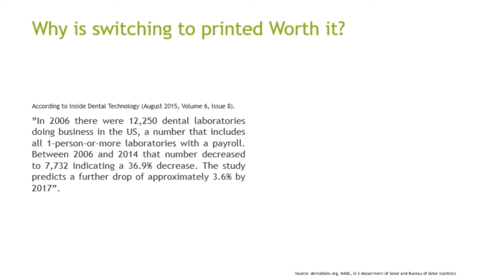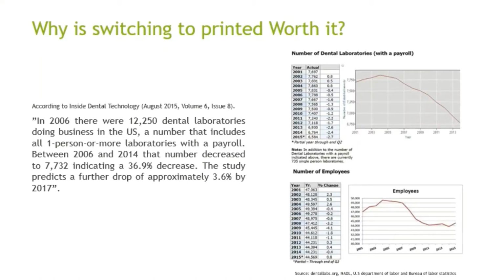But why is switching to 3D printed and CAD/CAM digital technology worth it for laboratories? In 2006, there were 12,250 dental laboratories doing business in the US. That number greatly decreased in 2014 to 7,732. Now in 2020, the numbers are expected to fall under 5,000. And not only that, but the number of employees per laboratory is also decreasing heavily as we move forward.